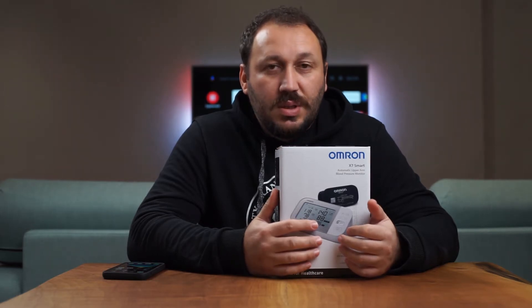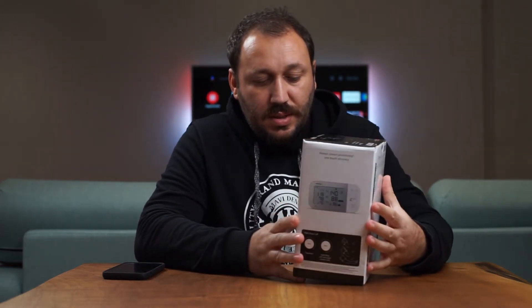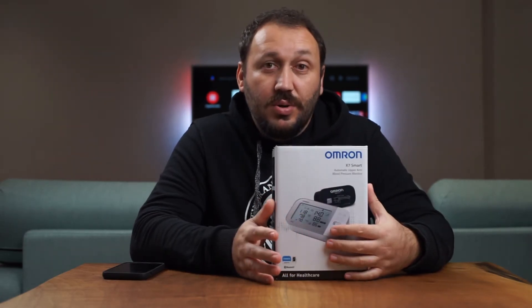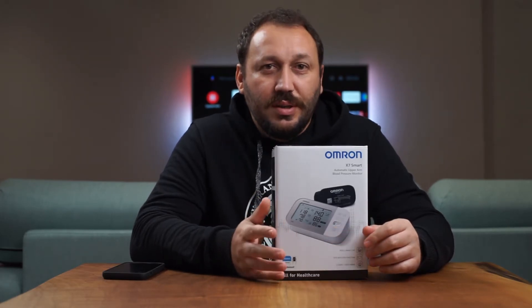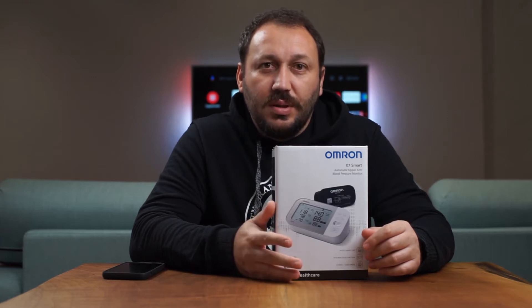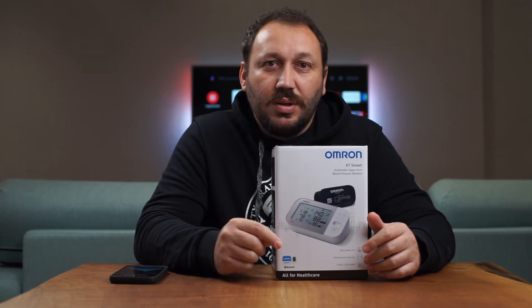I'm going to make a quick video about the Omron X7 smart blood pressure monitor. This version has Bluetooth and you can use it with iOS and Android phones to follow your readings. You can also link it with the iPhone Health application and whenever you take a reading it automatically syncs there.